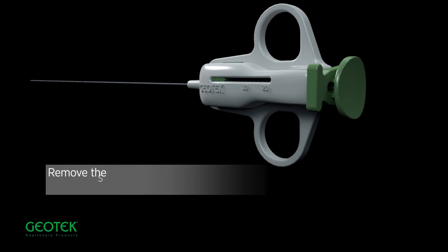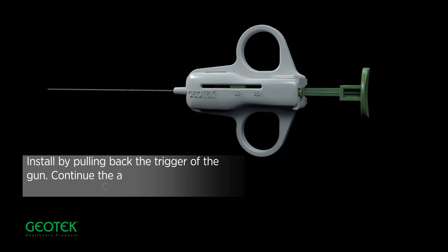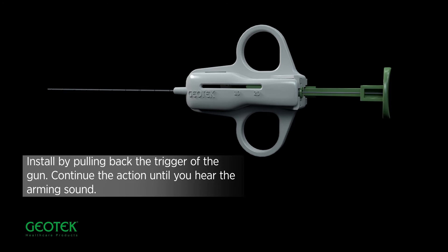Semi-automatic biopsy needle. Remove the safety device on the trigger of the biopsy needle. Arm it by pulling back the trigger of the gun. Continue the action until you hear the arming sound.